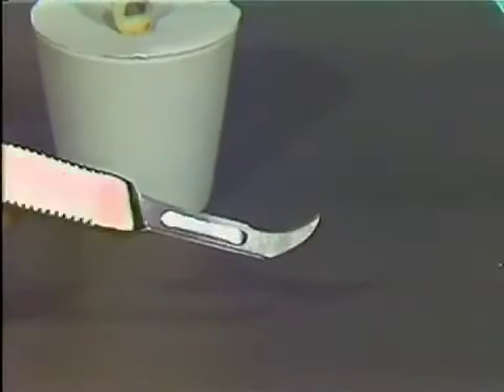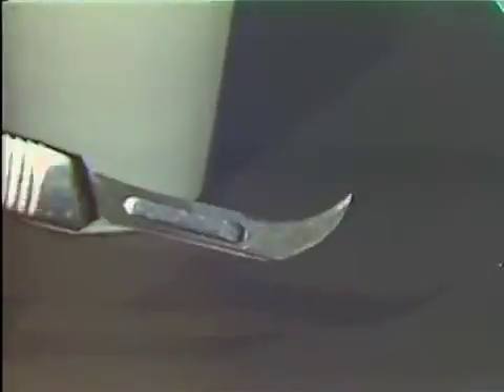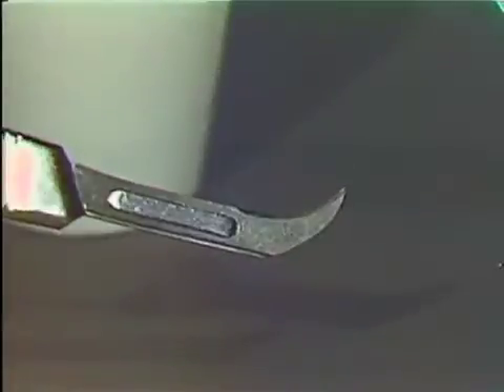This is a Bard-Parker blade, a number 12 blade, and it is primary in removal of overhangs — amalgam overhangs — interproximally.